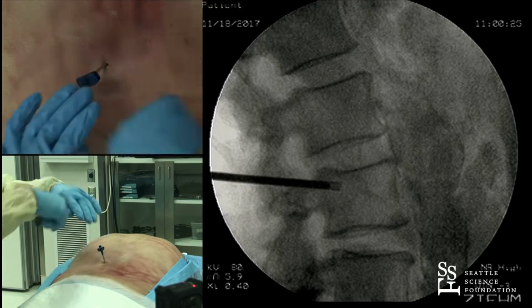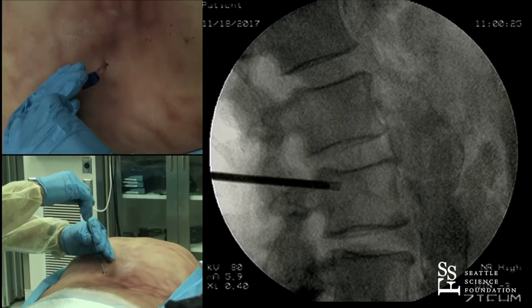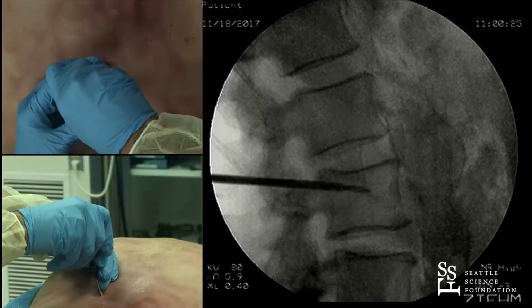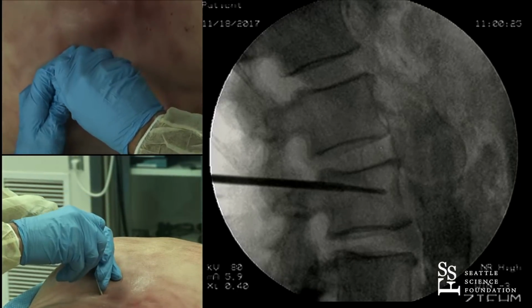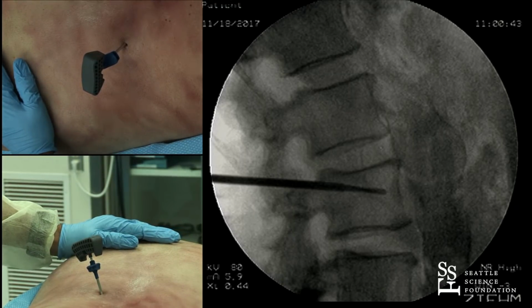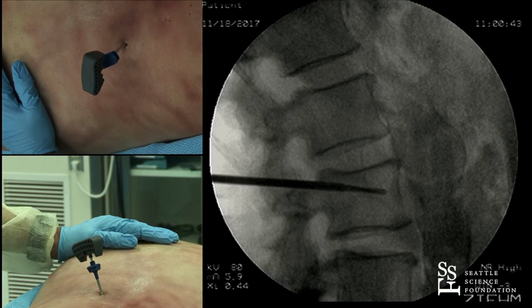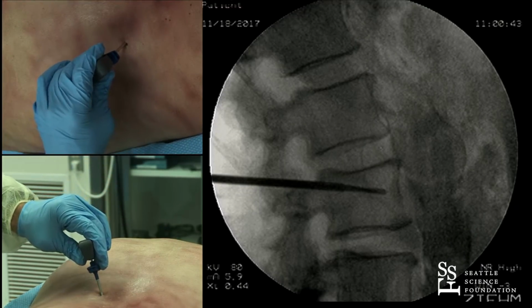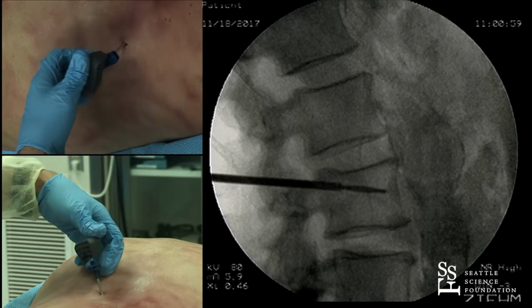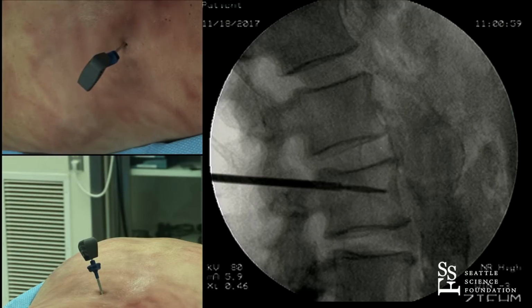Let's do this. And as Dr. Schonard mentioned, in the drilling you drill and use it live, and you don't drill all the way up to the anterior portion because of the curve of the vertebral body. You can be outside the vertebral body if you drill up to the very anterior most wall. So we drill like this, to within 3 to 5 millimeters of the anterior wall, perfect position right there. We'll come back around AP, and take a shot of that to double check our trajectory in the AP.